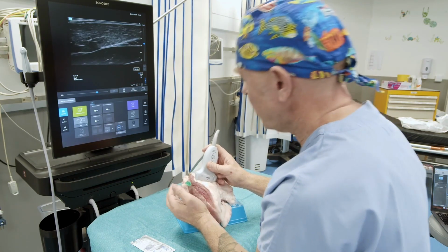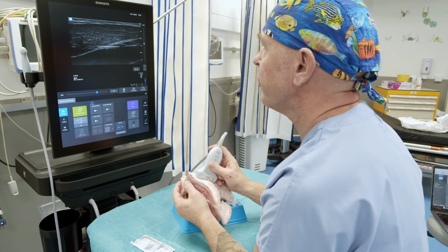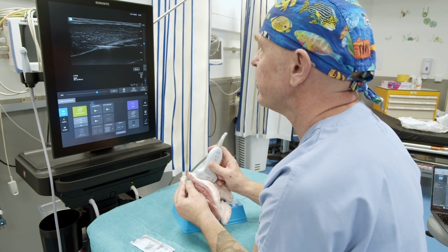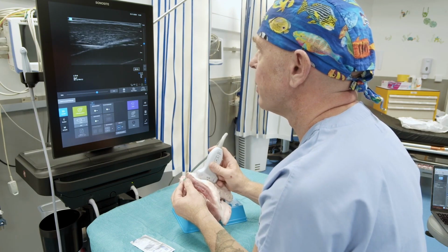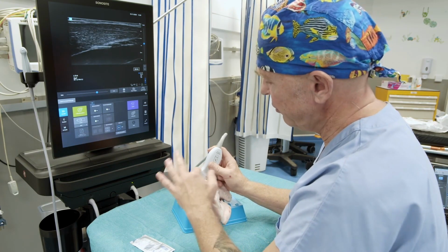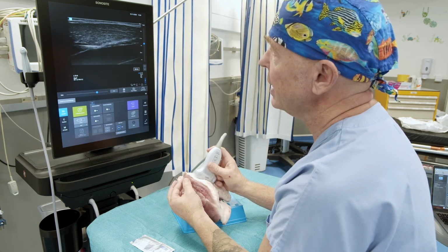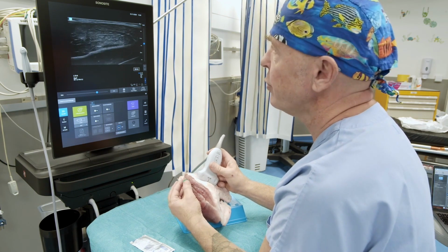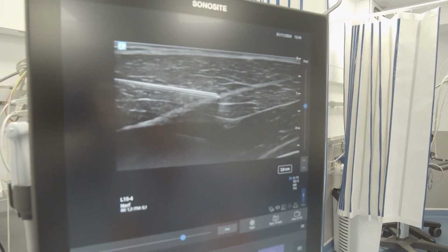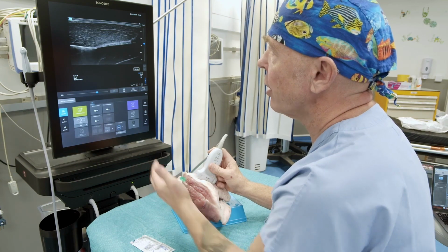You can engage in small practical workshops, and you observe I'm encountering a bit of difficulty because I took a slight orientation, so I redo it, and then I proceed a little here, for instance, right here. So if I had, you observe these small tilting movements and such. So a really important piece of advice: when you lose track, don't move both at the same time, because when you move both at the same time, you're completely off. You don't know what you're doing, and that's often what we see with beginners. So we can do another nerve. There you go, you see there perfectly.